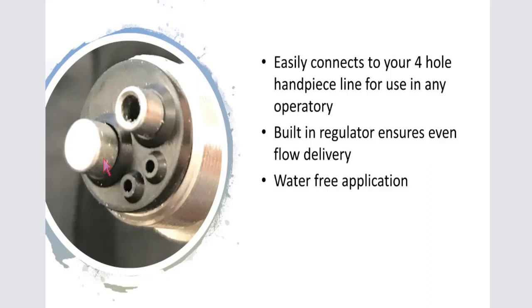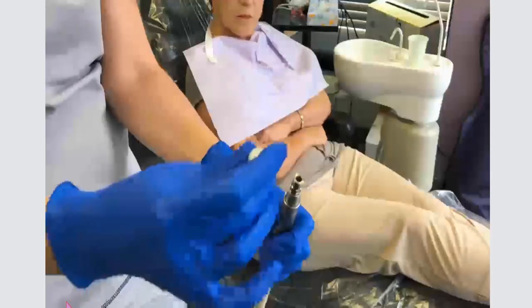That's very important because as you're going around the implant, and I'm going to go into how you're going to position this, water is not coming out, and many times you don't want to take anything with high pressure or water and go into the sulcus with it. That's not what we're recommending, and that in fact can cause several problems. So we're going to be very careful of how we are going in. I'm going to show you it clinically working. I've got a little video that's going to play, and I will talk you through this.